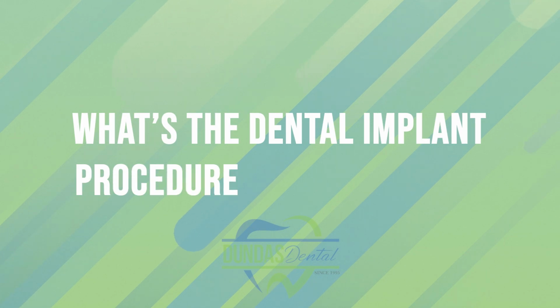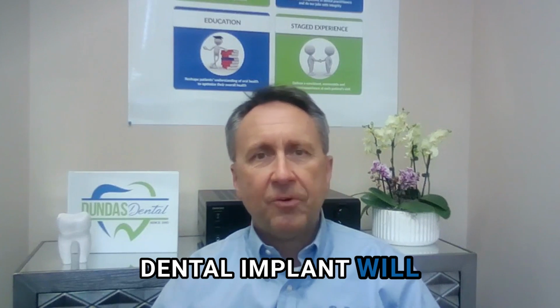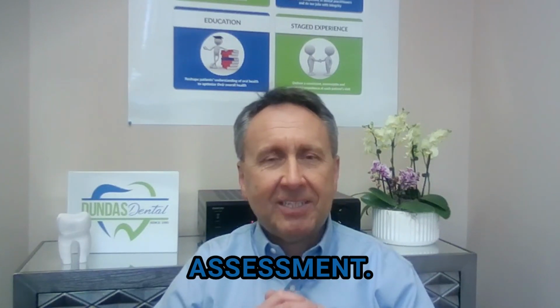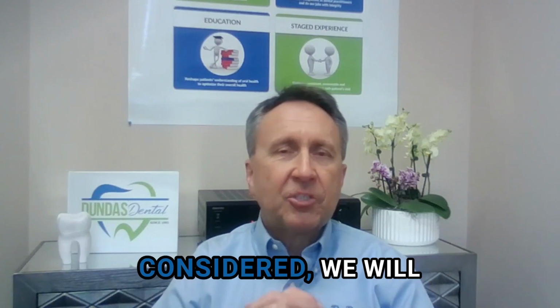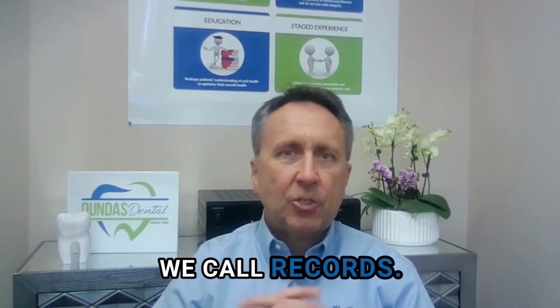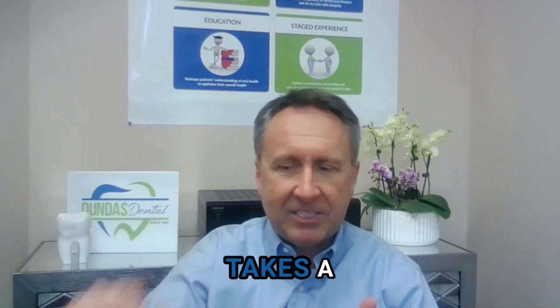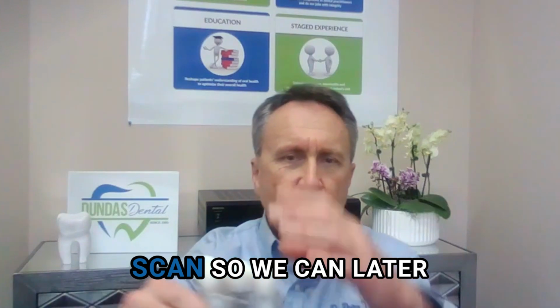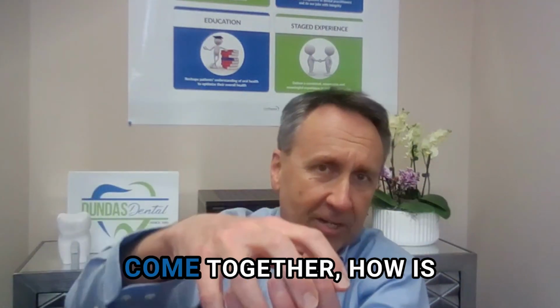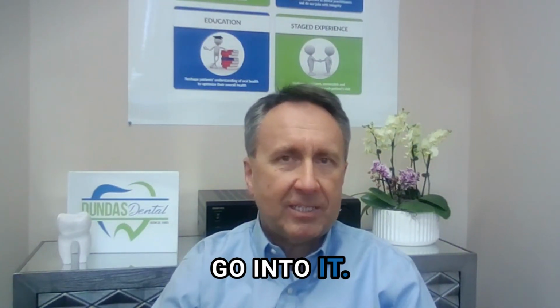What's the dental implant procedure at your office? Anybody who is interested in a dental implant will first come to our office. We will do a general examination and assessment. When the implant is considered, we will do special steps. We will collect what we call records. So we will do either a mold, or now we have a newer technology, a special camera that takes a three-dimensional scan, so we can later on get the models of teeth, see how the teeth come together, how the bite is, etc. Many considerations go into it.